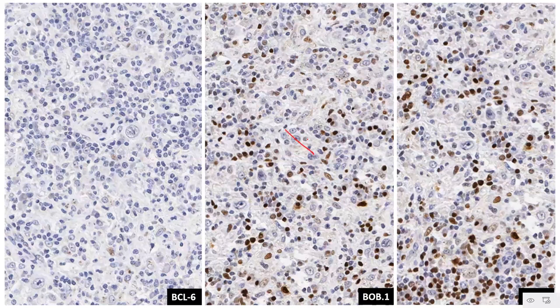So this is a negative expression of BOB1, as you see in this case, in the classical Hodgkin-Reed-Sternberg cell. BCL6 is again a germinal center marker, which can be seen in the case of NLPHL, but is not seen in the case of classical Hodgkin lymphoma. And this is OCT2. Again, no expression of OCT2.